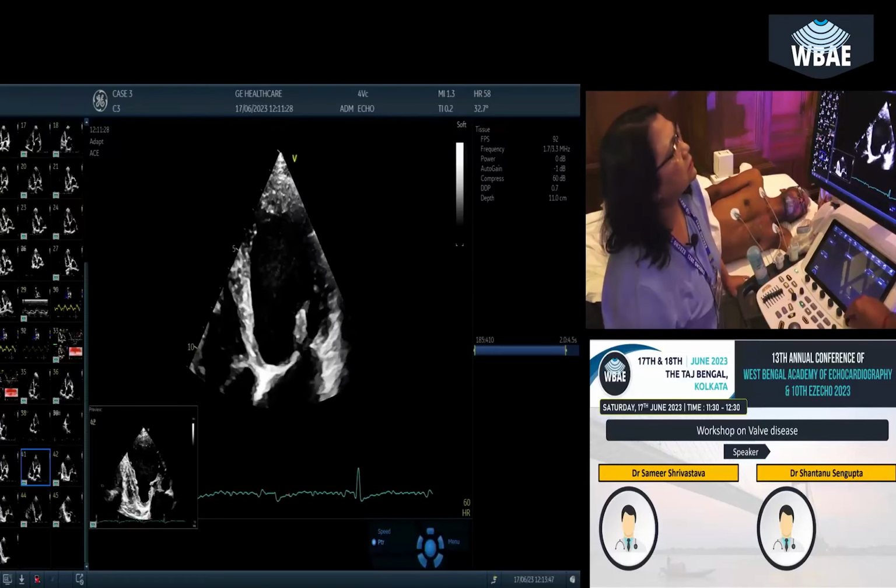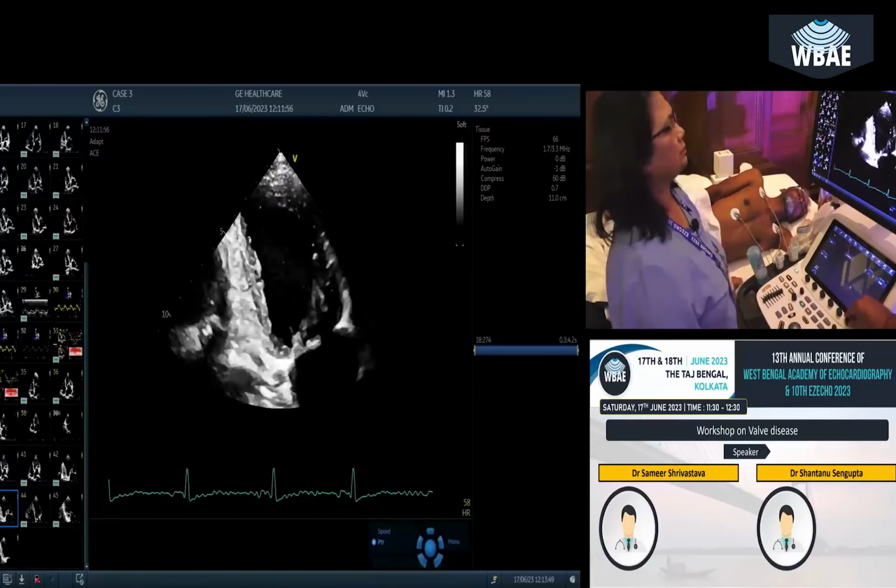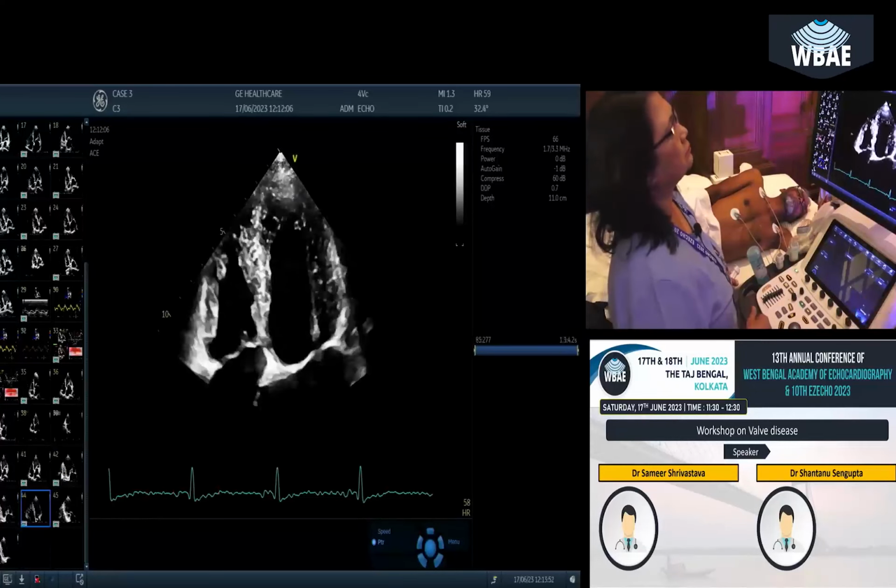No, that two chamber was good, Dr. Manu. This is pretty good. That is good. Let's do it. Ashish, let's do it.